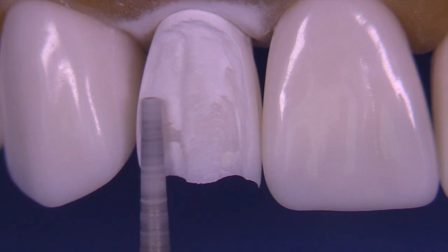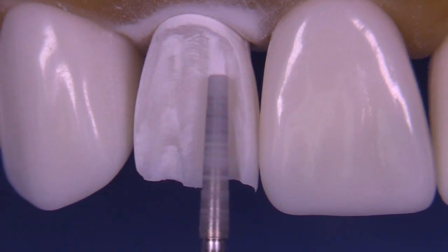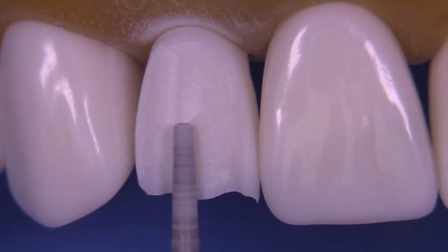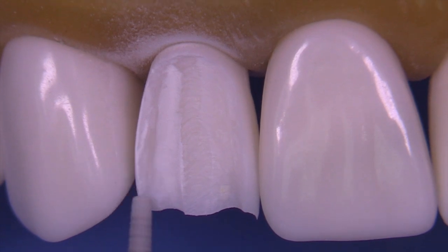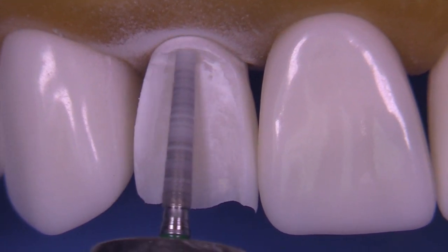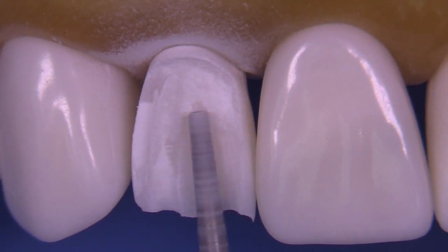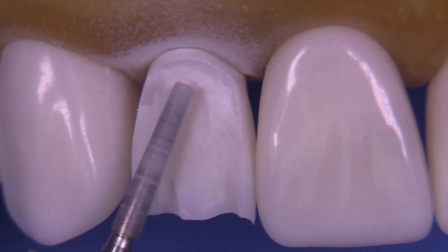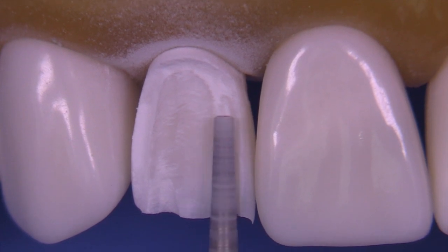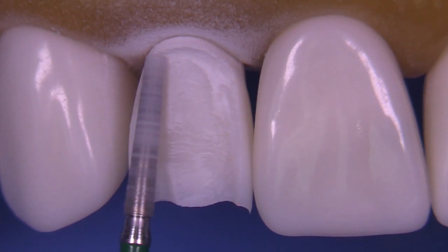We're just using the 6847 016 to create the facial reduction. The tip of this bur is about 1 to 1.2 millimeters, which serves as a nice guide for how deep the shoulder should be, and the widest part of the bur is 1.6 millimeters. The bur itself provides all of the reduction amounts needed for the facial reduction. We're continuing to remove the areas between the depth cuts and making it relatively smooth.